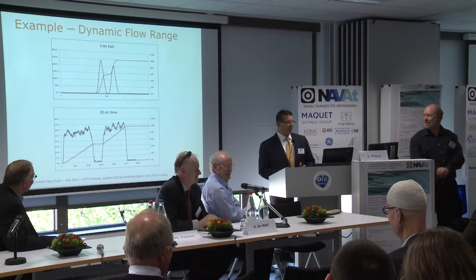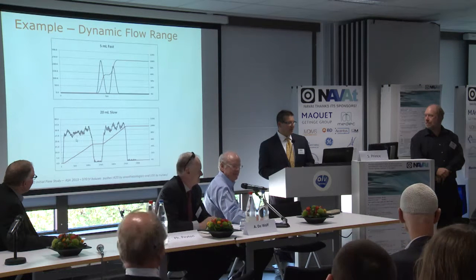Neither, actually. Believe it or not, as we go through the data, there is an awful lot of this. It's the combination of friction from the syringe plunger and any movement of the thumb that varies the pressure. Many people would have anticipated that you would see these nice bell-shaped curves, and I can just tell you for a fact it is not that way at all, especially when it comes to slower pushes.